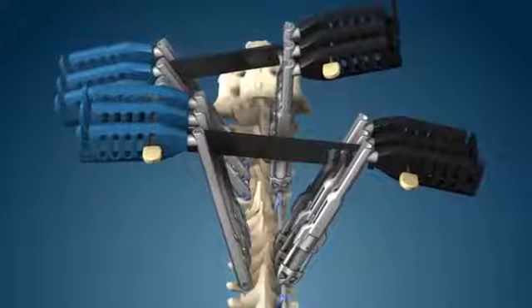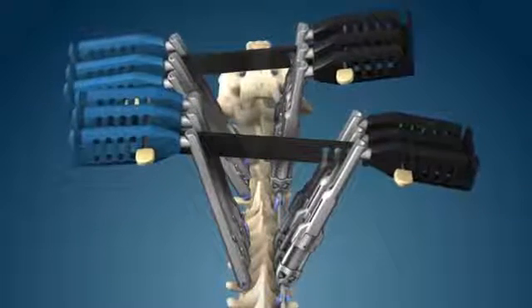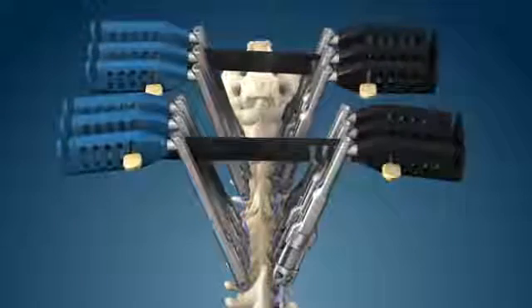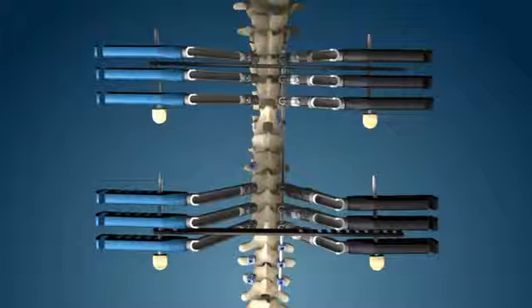The spine is derotated by slowly rotating the clusters in opposing directions over approximately 15 seconds. With the desired axial plane correction achieved, cluster alignment rods are inserted to hold the correction in place.